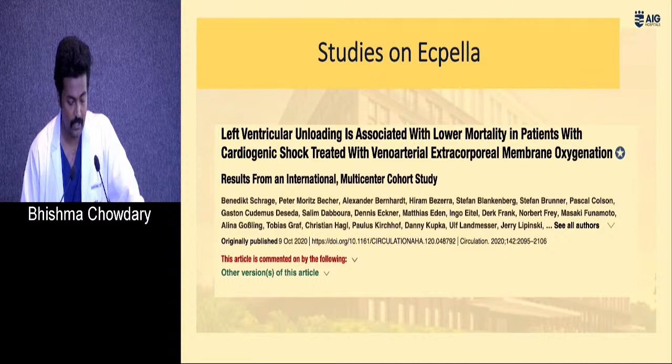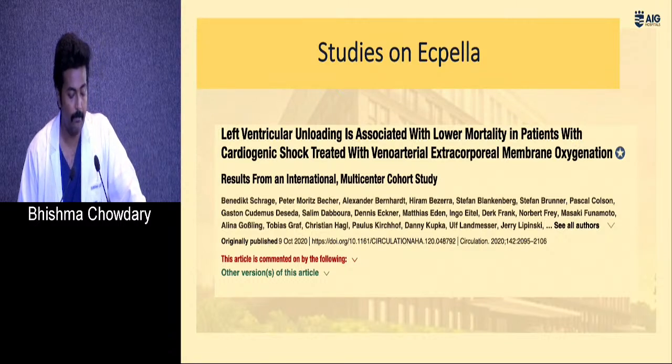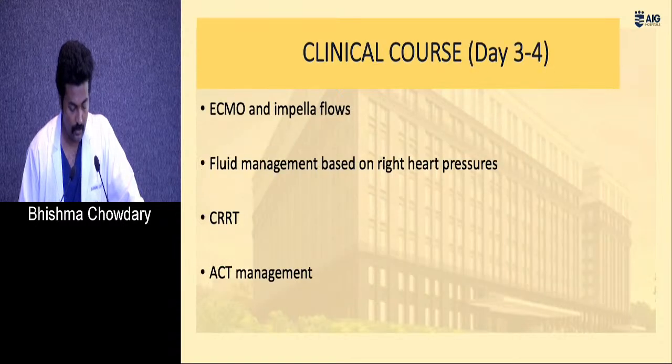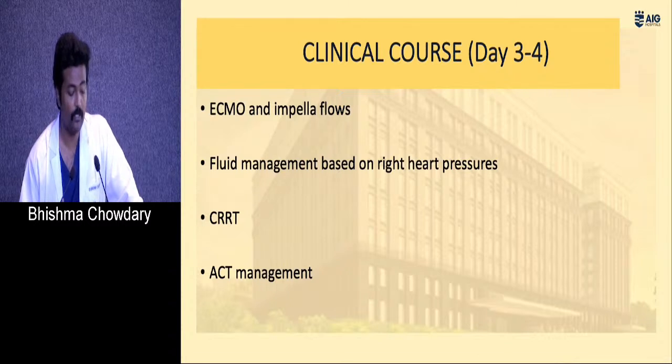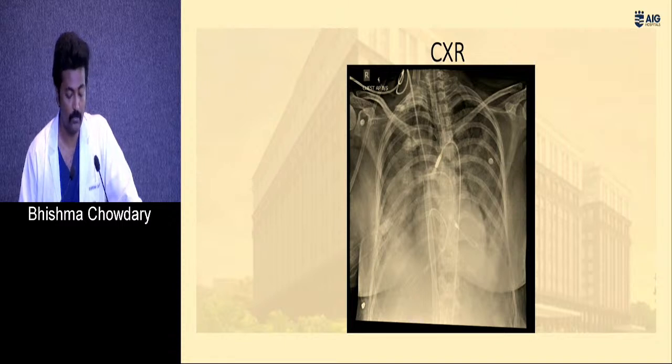These are a few studies on ECpella showing that putting on ECpella early in this subset decreases mortality. Coming to the clinical course of day 3 and day 4, once the ECpella was in, the fluid management was done based on the right heart pressures. The patient was put on CRRT and the ACT was managed appropriately. Chest X-rays started to show some improvement. The pulmonary edema was slowly settling down.